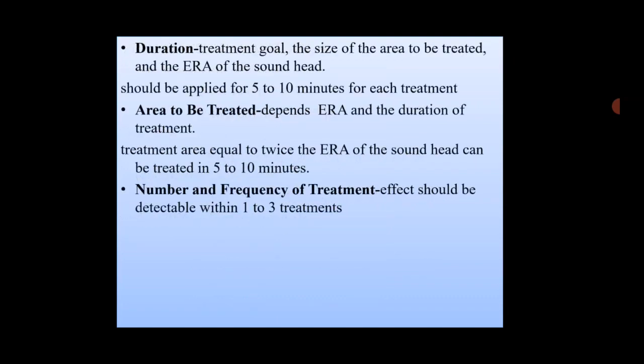Then coming to the duration, the duration is based on the treatment goal, the size of the area to be treated, and the ERA of the sound head. So 5 to 10 minutes for each treatment is found to be effective. The area to be treated depends upon the ERA and the duration of the treatment. So always the treatment area should be equal to twice the ERA of the sound head and can be treated in 5 to 10 minutes.